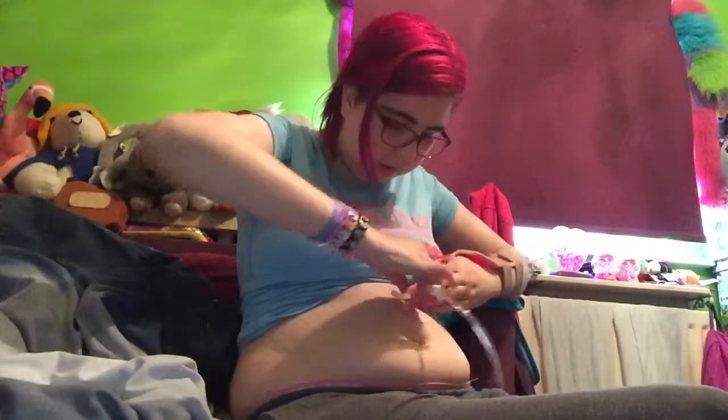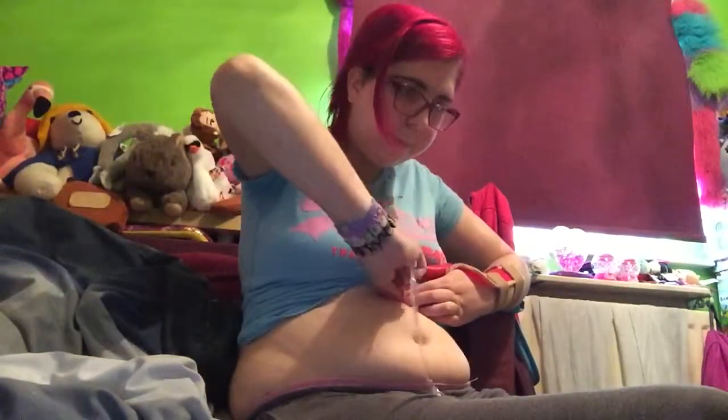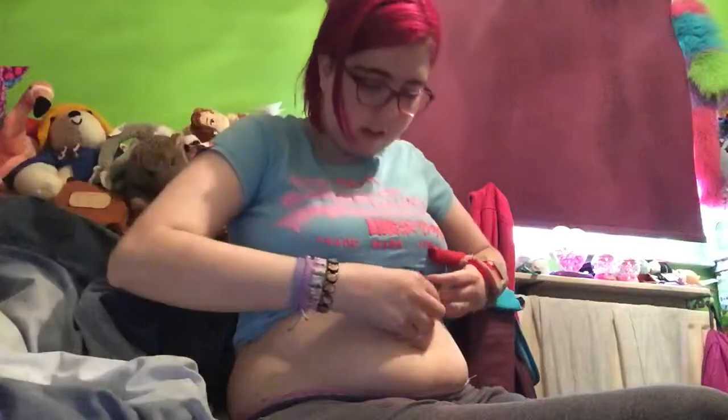It can be a bit fiddly, especially the way my hands are. Sorry about this. So that is it unconnected, and I am just going to close the PEG, and like so, nobody would know that I have a PEG, so I'm so lucky in that way. But this is important, that I've made this video so people do know that I have a PEG and how a PEG has helped me and how it's used.